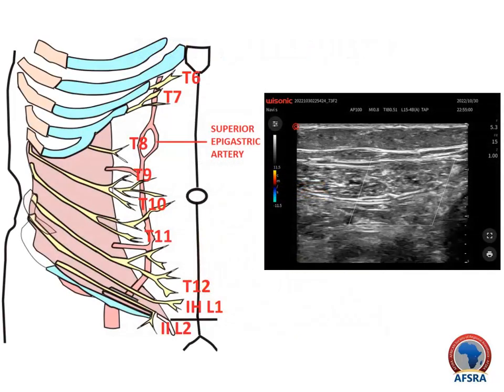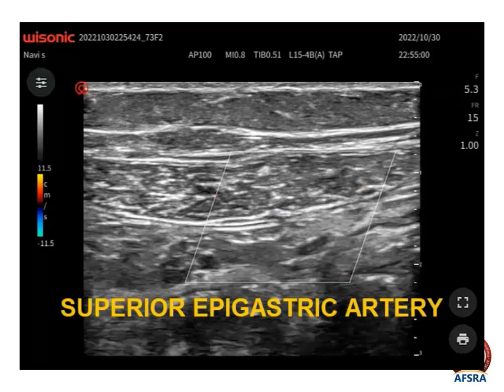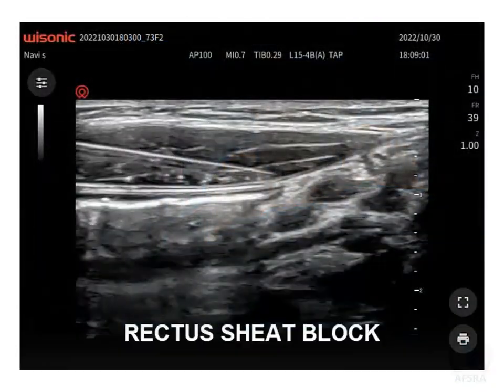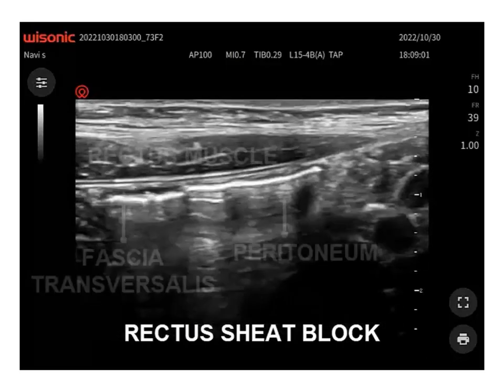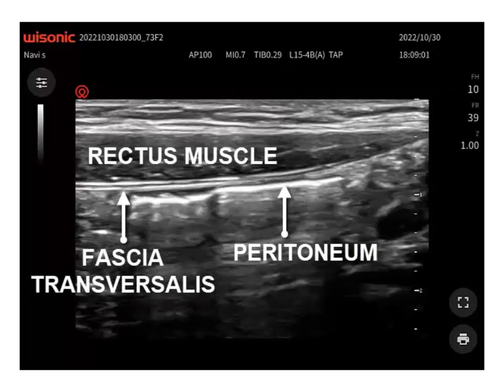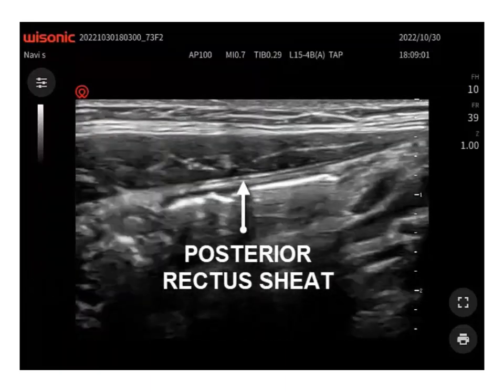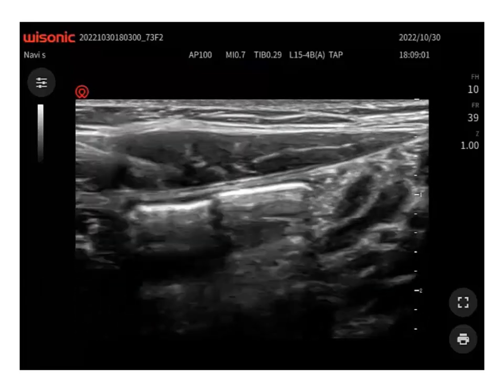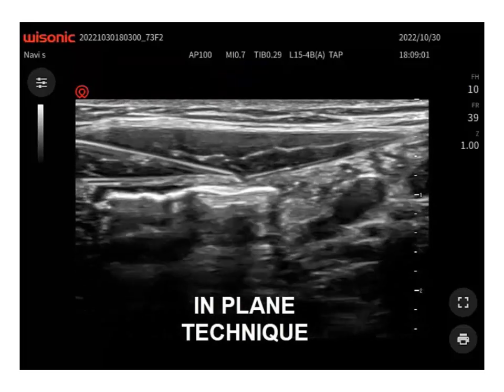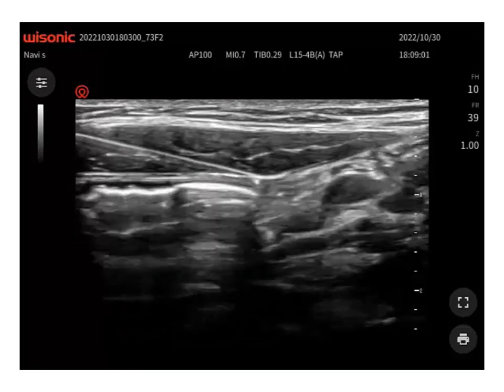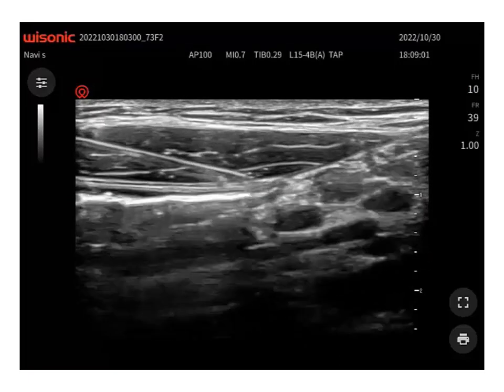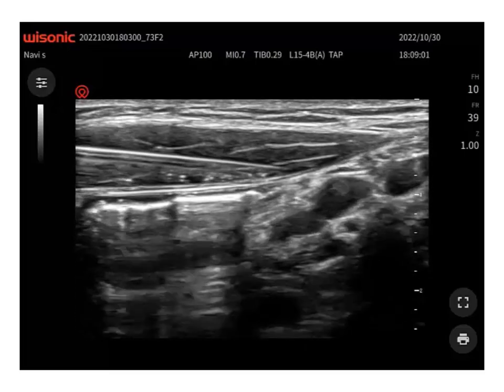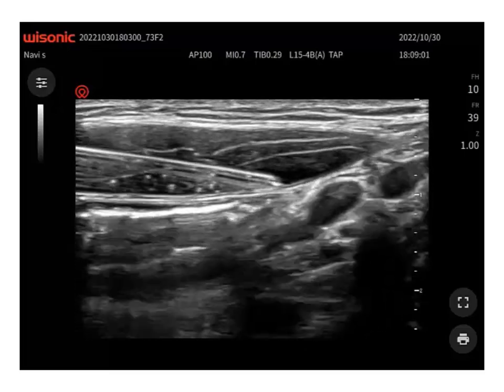Local anesthetic deposited in the rectus sheath by simple injection or with catheters is used to provide analgesia to the anterior and medial abdominal wall. Under ultrasound guidance, the local anesthetic or catheter is placed in the posterior rectus sheath, between the posterior sheath and the posterior portion of the rectus abdominis muscle. This video shows how to perform the rectus sheath block.